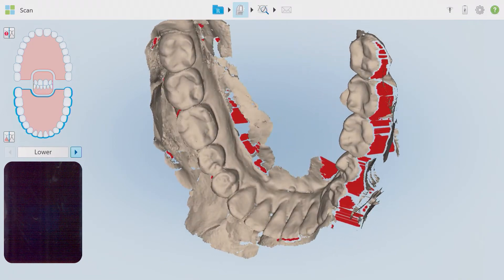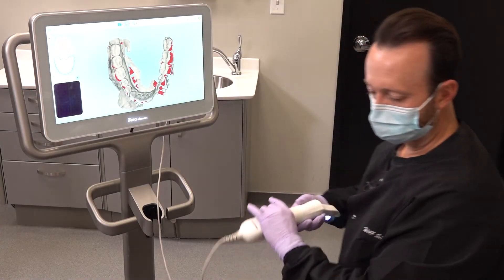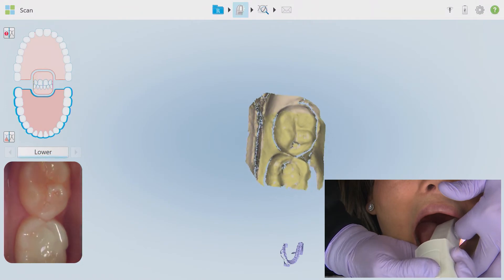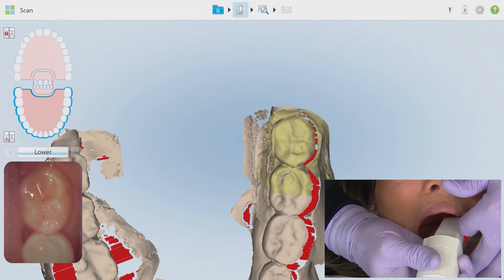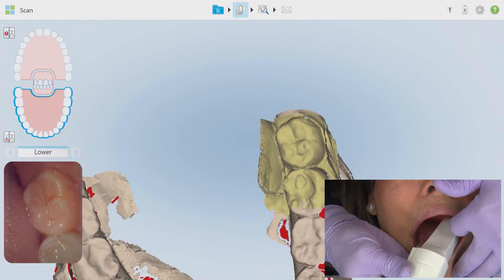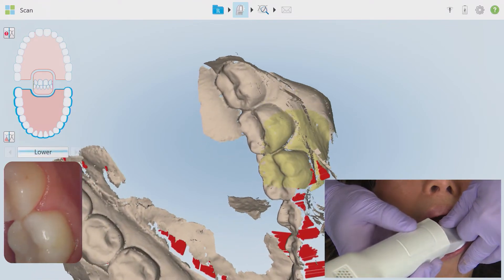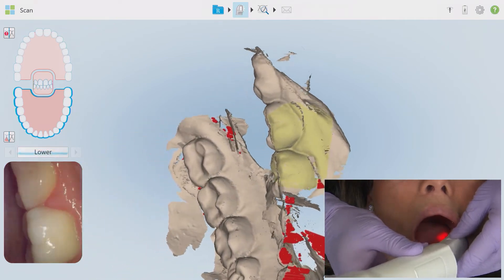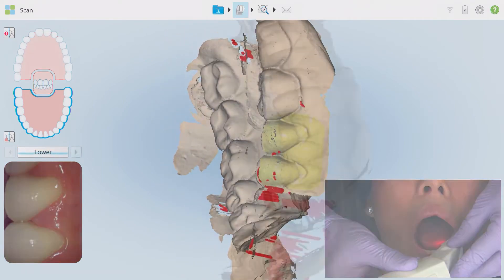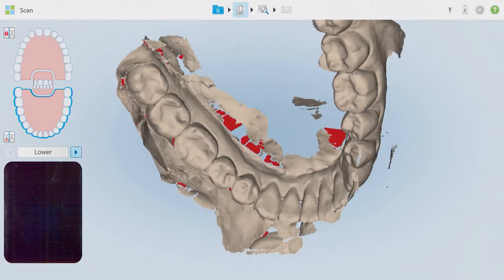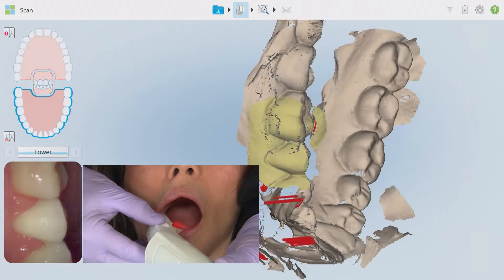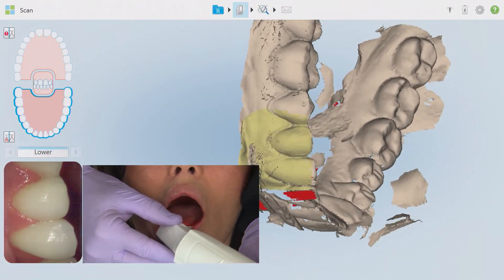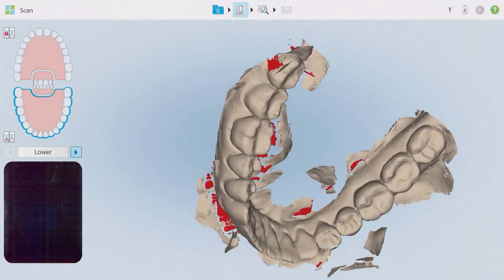This scan looks clean so I can continue to the buccal. For the buccal scan, I'm going to do it a quadrant at a time and stop at the midline. Starting from the distal of the most posterior tooth in the arch, I'll once again scan the occlusal until the previous scan meshes together. Now that the full image is displayed, the wand rocks to the buccal and moves towards the midline, staying as close to the teeth as possible. To reach the difficult interproximal areas here, instead of the twisting method we used on the lingual, I'm going to lift the tail end of the wand up and down while progressing towards the stopping point at the midline. Just taking a quick look here before moving to the adjacent arch, and everything looks to be in order, so I'm going to go ahead and move on. Now I'm always starting on the flat occlusal surface, allowing the scans to mesh, and then I move along the buccal in the same fashion towards the midline. Give every segment a quick check to make sure you get the right information recorded.